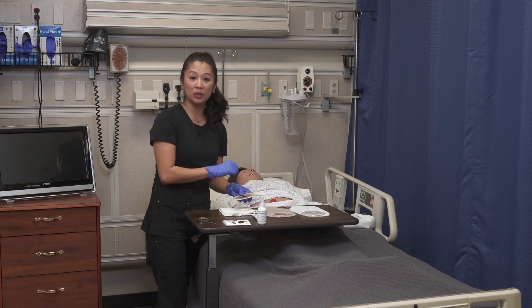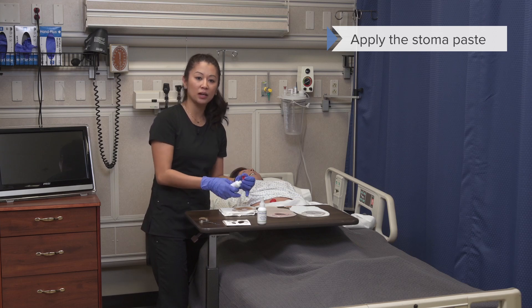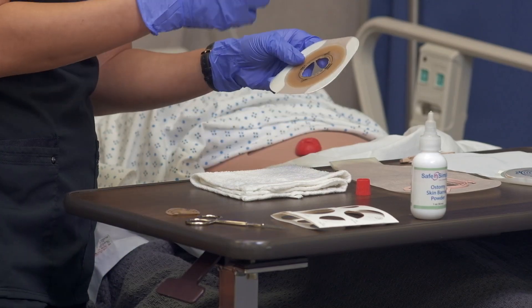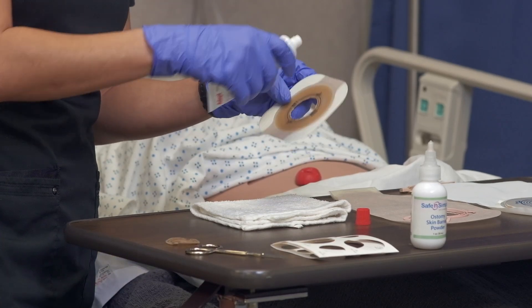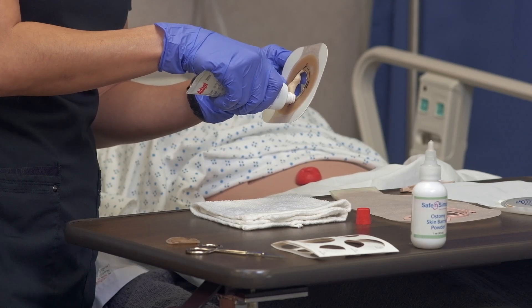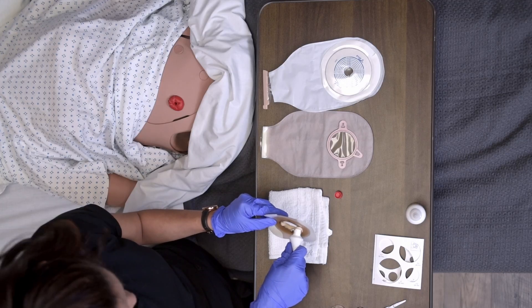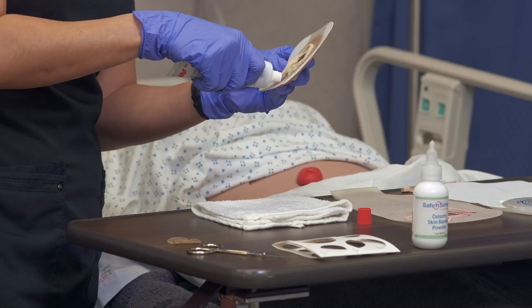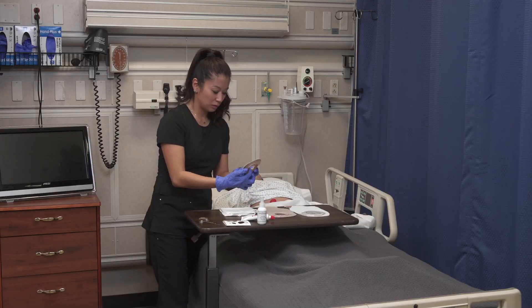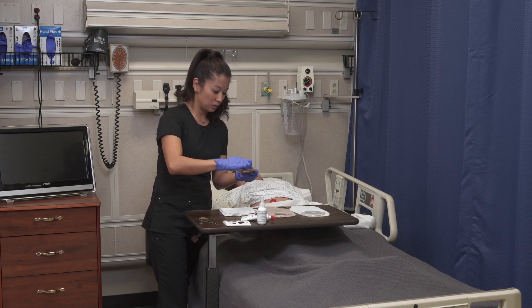Now is a great time to apply the stoma paste. This is really helpful if there are any little gaps between the stoma and the wafer, and it helps reduce leakage. Take the stoma paste and apply a thick little circle around the wafer opening. Sometimes it's not very pretty, but that's okay. Just make sure it's applied all the way around that area.